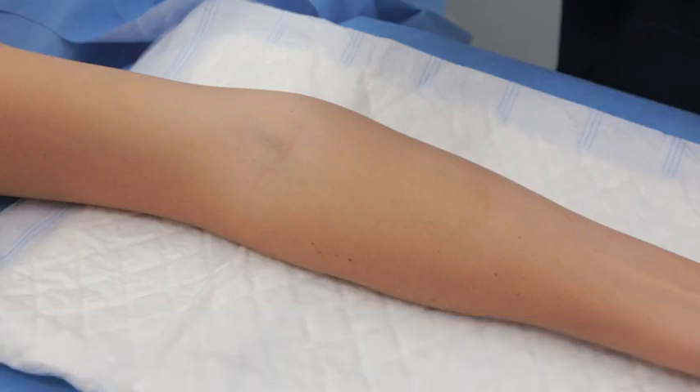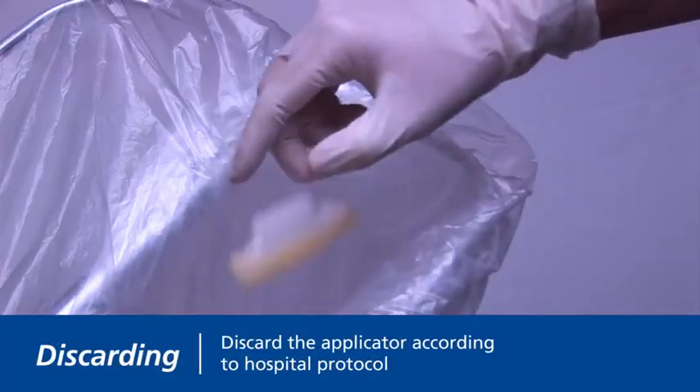Your site is now prepped and ready. Discard the applicator after a single use.